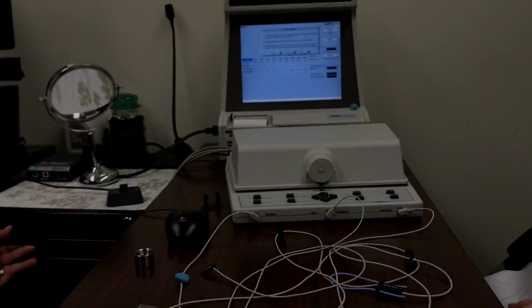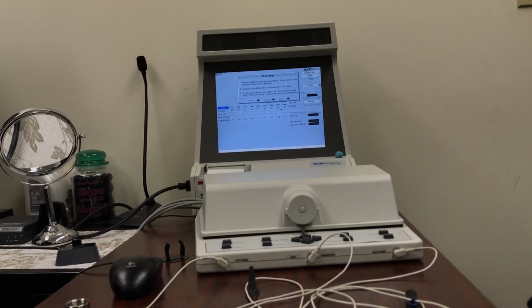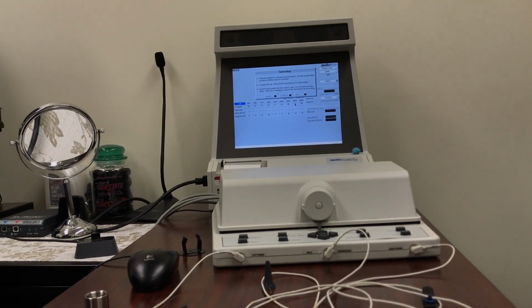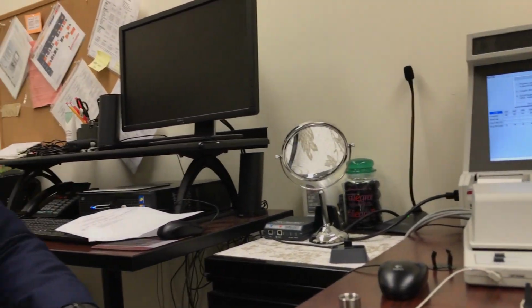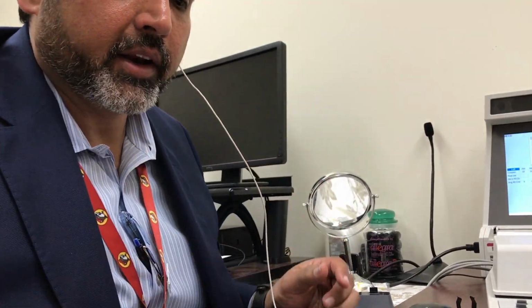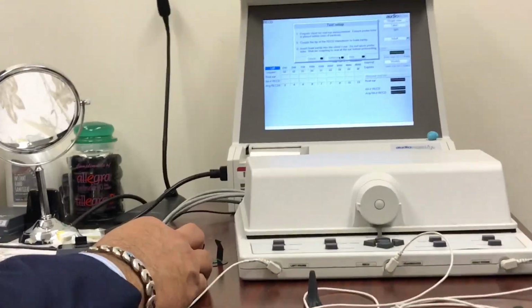Do we have any ear plugs in here? Yeah. Usually I leave them all in the booth. Would one of you mind grabbing one, and I'll do this on myself? That's a pretty cool little contraption. Now open up. Make sure you let it open. And I'll hit continue.